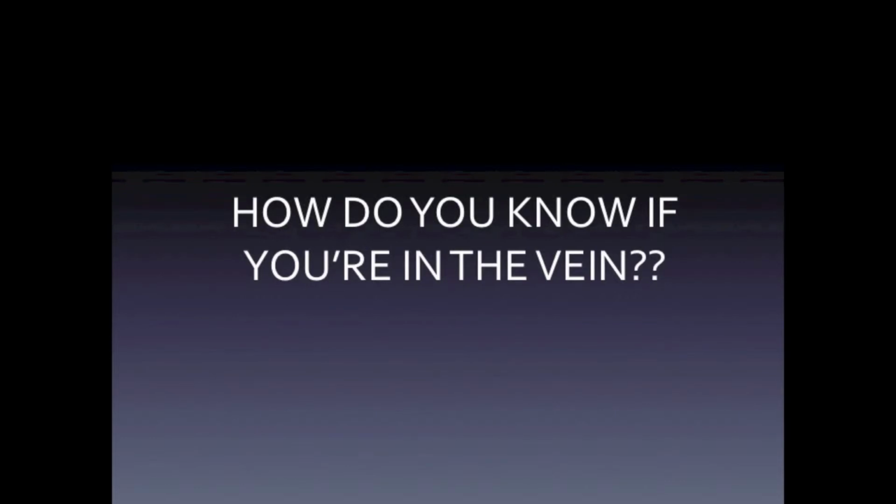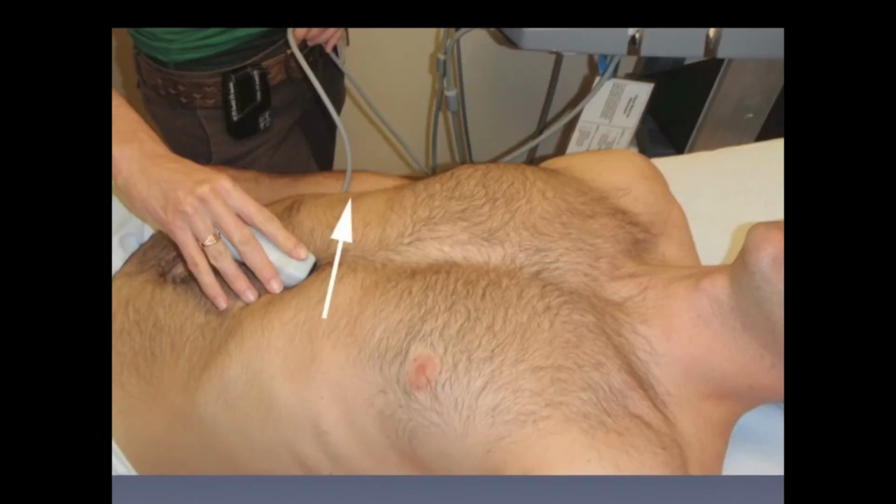Finally, in addition to possibly using the ultrasound guidance during insertion of the needle in the vessel, transducing the blood return, or examining the color of the blood, the technique we would like to focus on is visualizing passing of agitated normal saline within the right atrium. This can be done by placing the curvilinear probe of the ultrasound in the subxiphoid region with the marker dot toward the patient's right side or right shoulder.